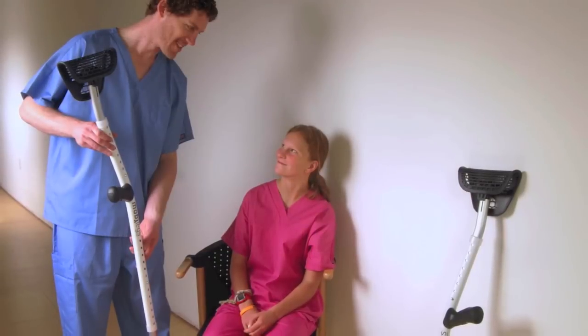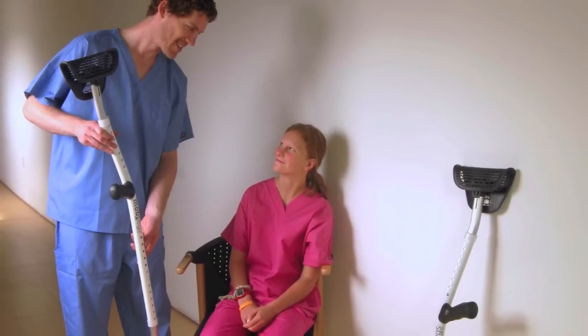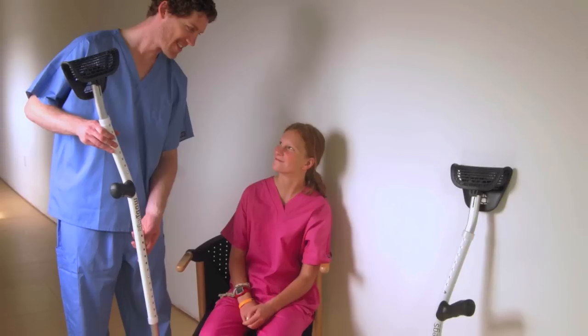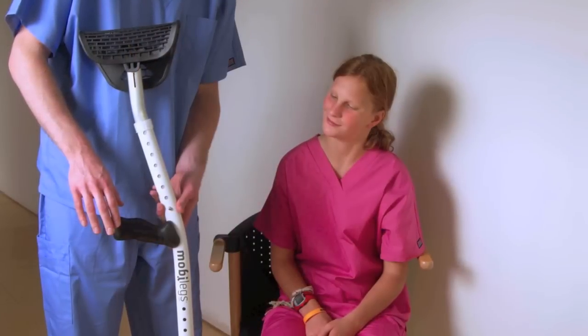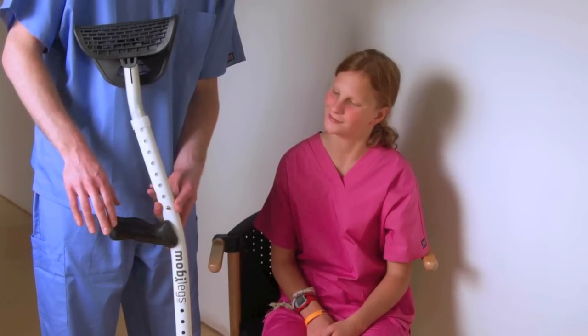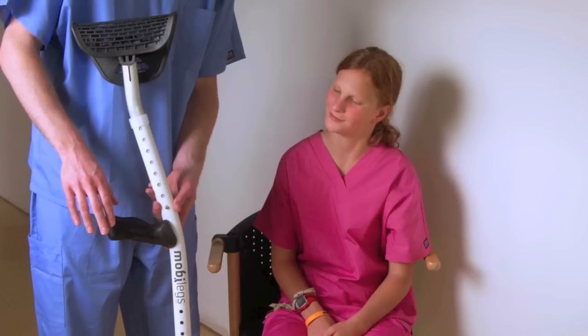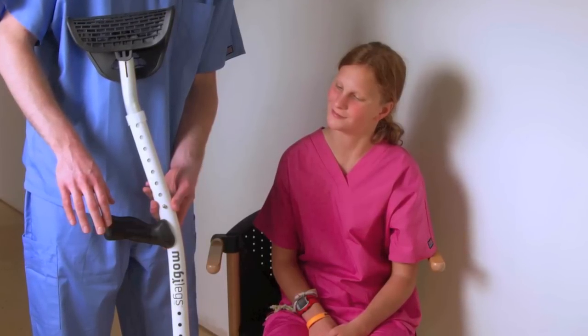To realize the benefits of the ergonomically correct design, be sure to properly identify the right hand and left hand Mobilegs. You will immediately notice how the handle is properly angled to keep your hand, wrist, and arm in a neutral position. This patent-protected design feature ensures your arm is in a position of optimal strength and comfort.